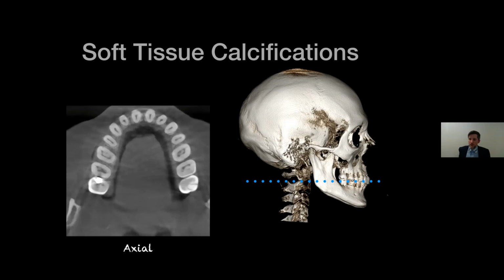Someone asked, do you take bite wings as well as cone beam for caries diagnosis? Yes. Again, I would not feel comfortable diagnosing incipients in cone beam, so I would say bite wings as well as a cone beam. A lot of people took a pan and bite wings back in the day, but nowadays a lot of people just take a cone beam and bite wings as well.